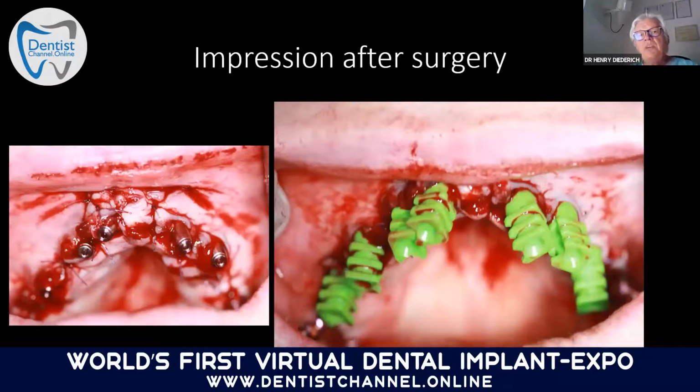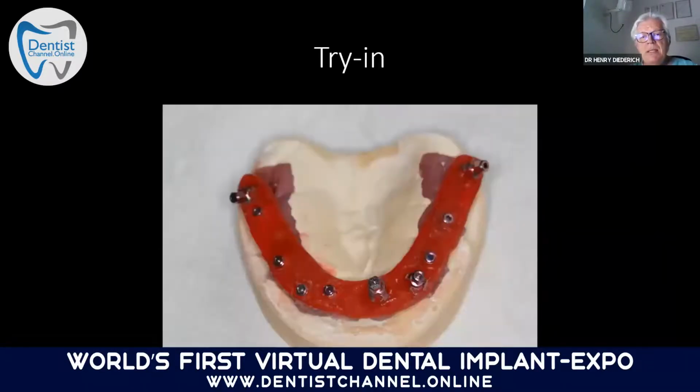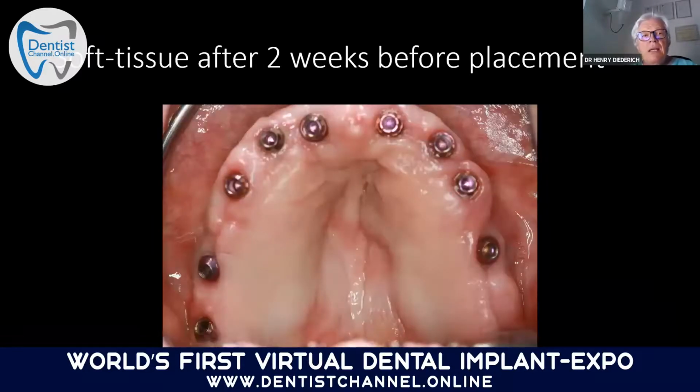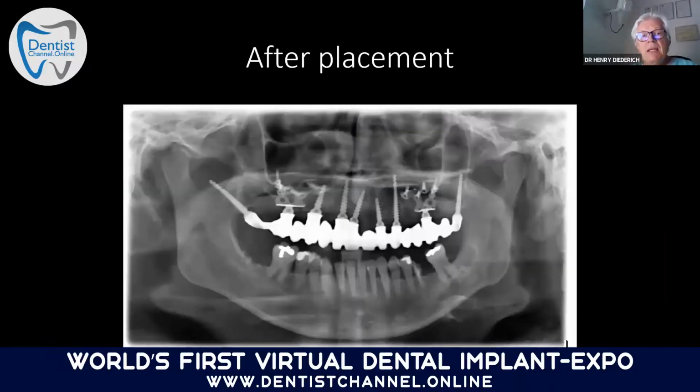We could take the impression after the surgery. Impression was done. We did a try-in after 4 or 5 days, with the framework. And here it took a little bit longer, 2 weeks before placement. See our soft tissue. And our metal ceramic bridge was realized and placed. And here was the result after the placement.